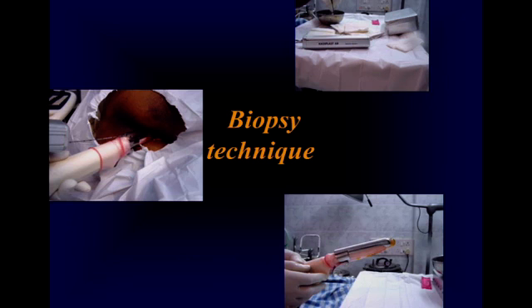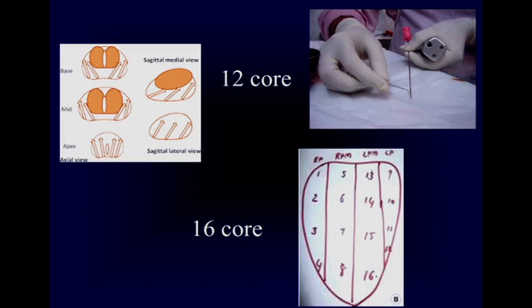For prostate, we again make sure that the area where we are working is cleaned properly with betadine. We also make it a habit to inject some local lignocaine jelly within the rectum and keep it for some time before we start with the biopsy. Some people like to infiltrate lignocaine in the periprostatic area, but generally we do not do that. Again, we take proper aseptic precautions.